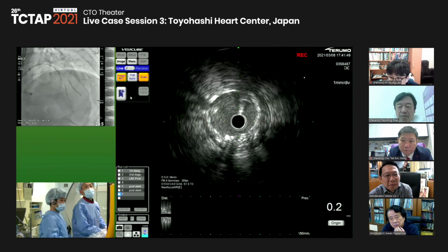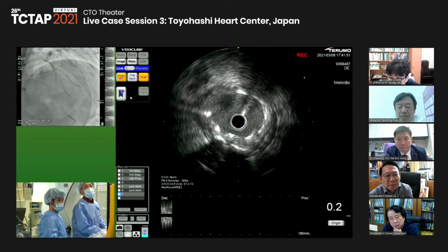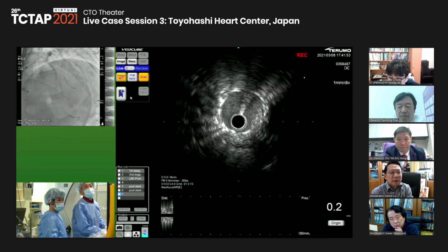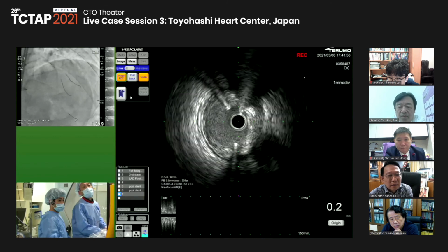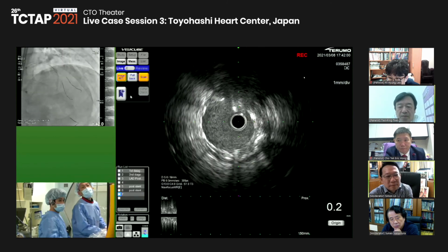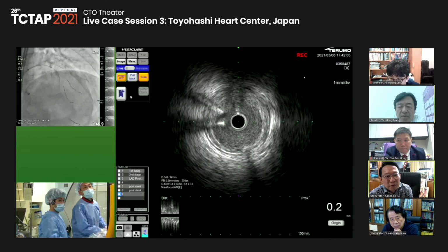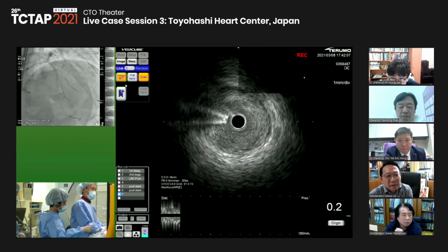The first diagonal is maybe well opened, I guess. So the issue is the proximal edge. The proximal edge is also maybe not so diseased. I think it's acceptable. So let's check the angio.